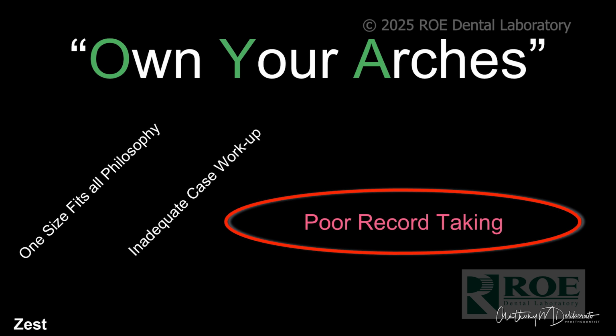I also find that lab technicians, when you give them beautiful models, where the stone is smooth and polished, they call you and say, this is beautiful, and they want to do the same for you. The better you give them, the better they're going to give you. So it's a good strategy to really get a good service from the lab.